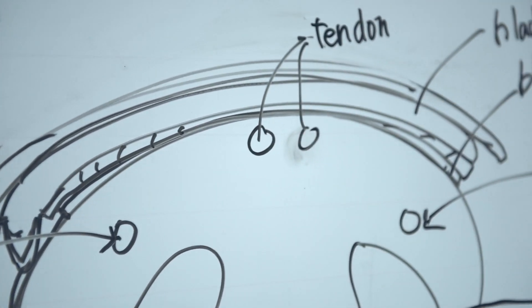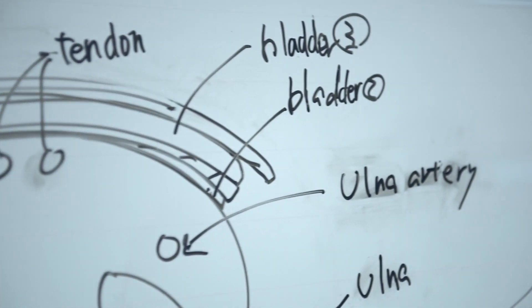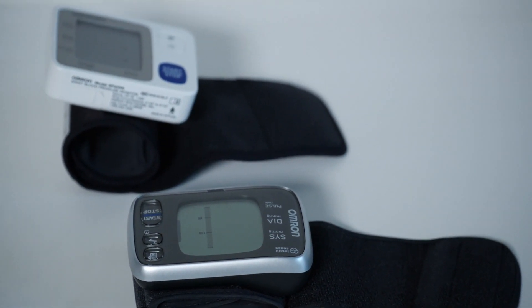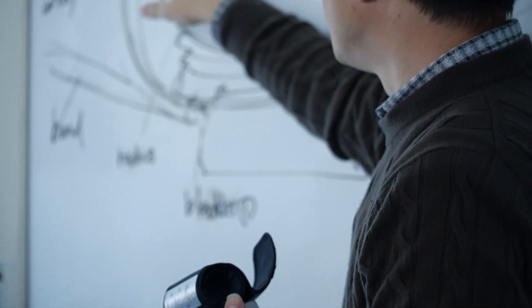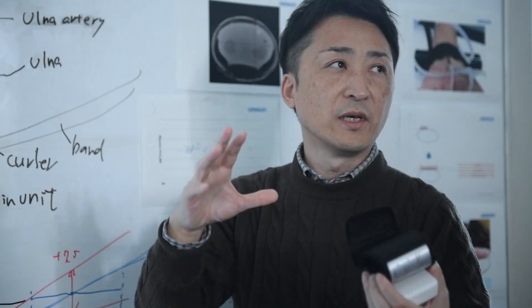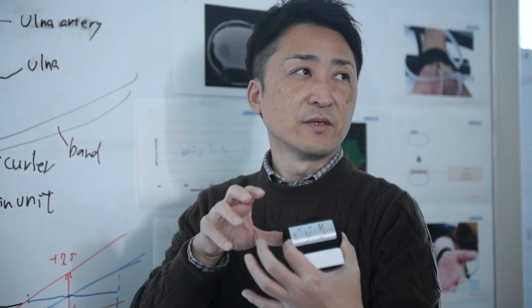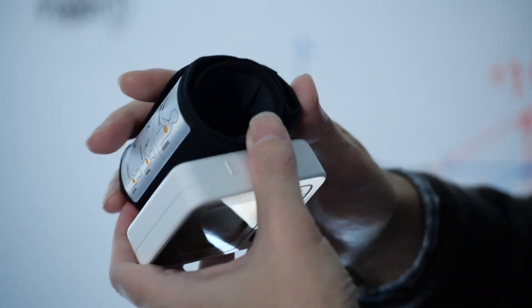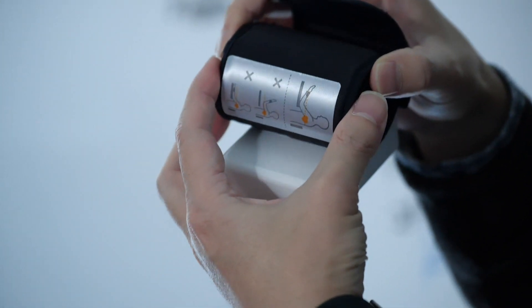First of all, in order to measure blood pressure accurately at the wrist, two arteries that run through the wrist need to be compressed evenly. Conventional blood pressure monitors use a wide cuff like this. This single cuff has two functions: it compresses these two arteries, and while the compression is going on, it also measures the blood pressure. You can do that with this cuff because it has substantial width.